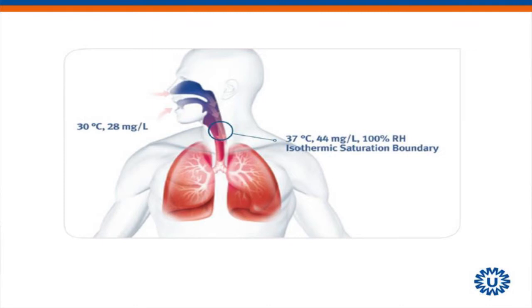In your breathing circuit, the 37 degrees Celsius is getting much warmer. It's warming the air up to 40 degrees Celsius before it goes into your endotracheal tube. Then, it's cooling down to dew point, 37 degrees. When the air is cooling down to 37 degrees dew point, excessive water vapor will come out of the gas. That's why your endotracheal tube contains humid. So 37 degrees on the pot, 40 degrees close to your patient, 37 degrees into your patient.